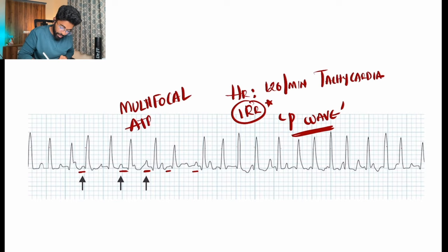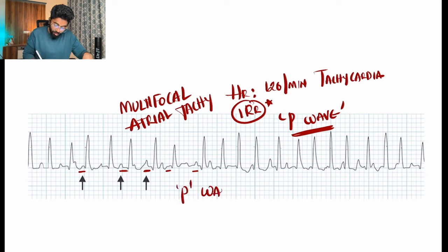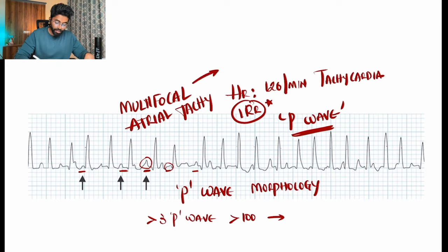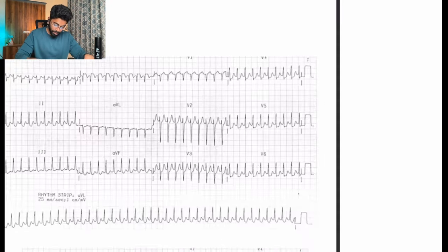For this ECG: heart rate is 126, irregular rhythm, and we can see P waves with different morphologies. Different foci are producing different kinds of atrial contractions, resulting in different P wave morphologies. To diagnose multifocal atrial tachycardia, more than three P wave morphologies should be present with a heart rate of more than 100. This condition is most commonly seen in patients with COPD.